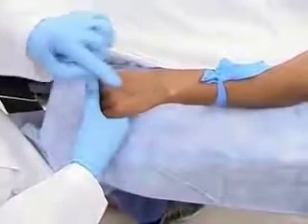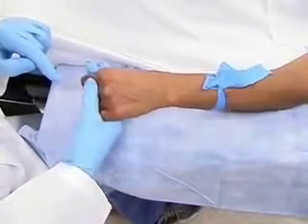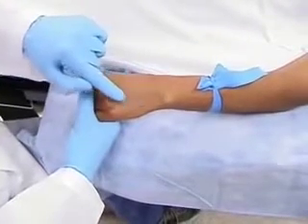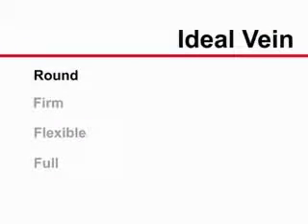When evaluating a vein for cannulation, inspect and palpate the available veins. Gently tilt the extremity or adjust the angle of the light to reveal better the contours of the vessel. To palpate a vein, place 1 or 2 fingertips over the selected vein and gently apply pressure. Release the pressure to watch and feel the refilling rebound of the vein. An ideal vein feels round, firm, flexible, and full.